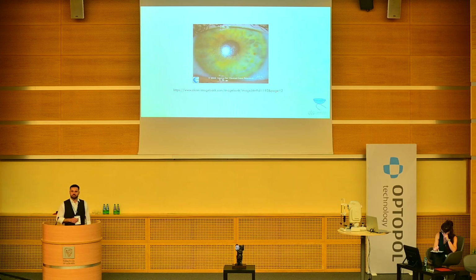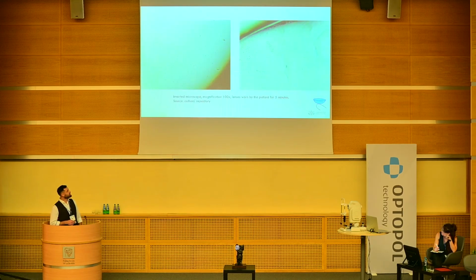And we also know that in terms of silicone hydrogel contact lenses, right now the most often fitted and most often used type, especially when it comes to reusable contact lenses, can be quite problematic for the ECPs, the eye care professionals. And just to add to that, this is the photo of the lens after wearing for several days, but this is the photo from microscope after 5 minutes of wear. And even after 5 minutes, you can see a lot of deposits on it.